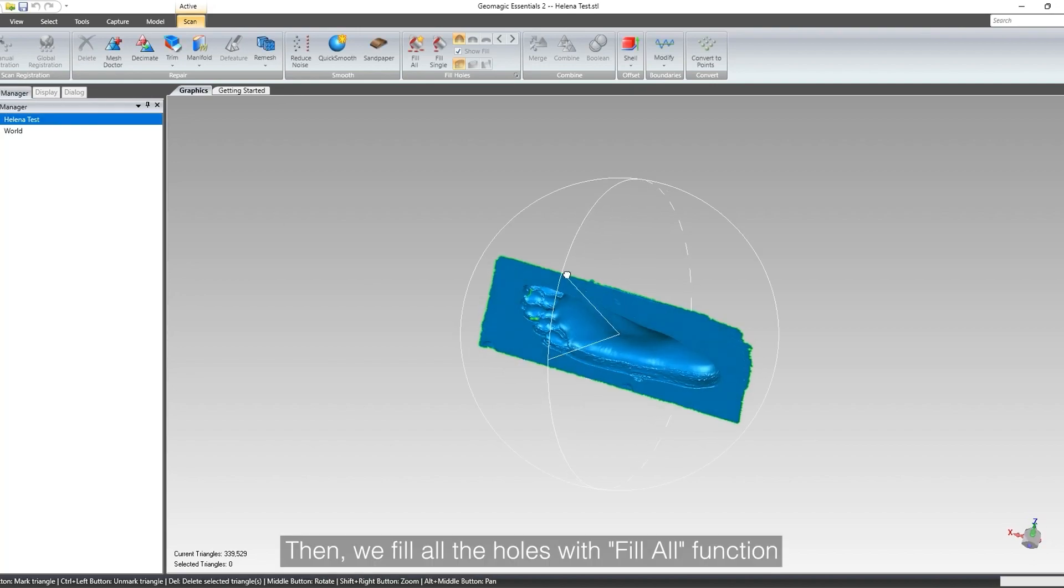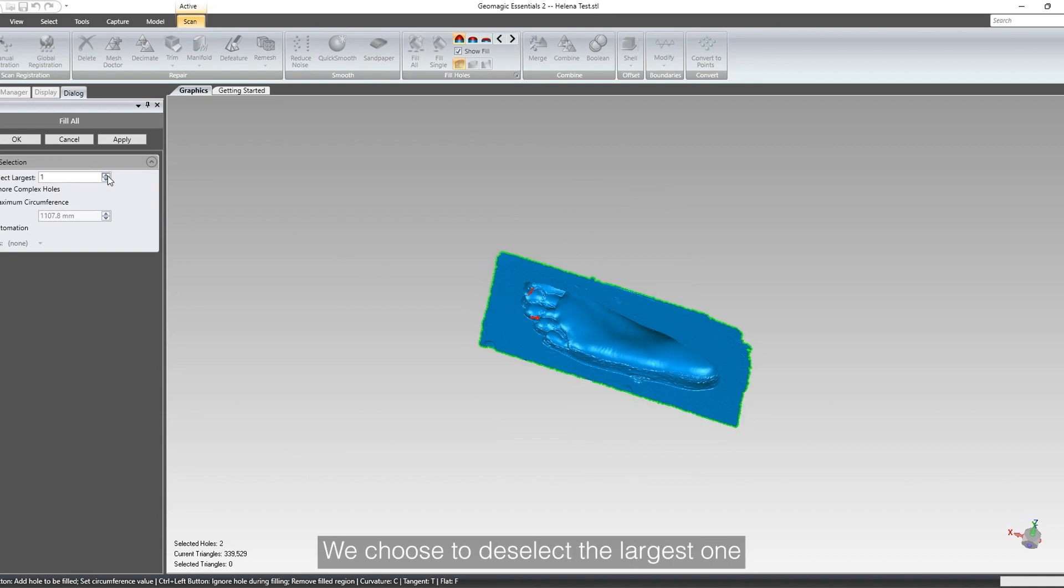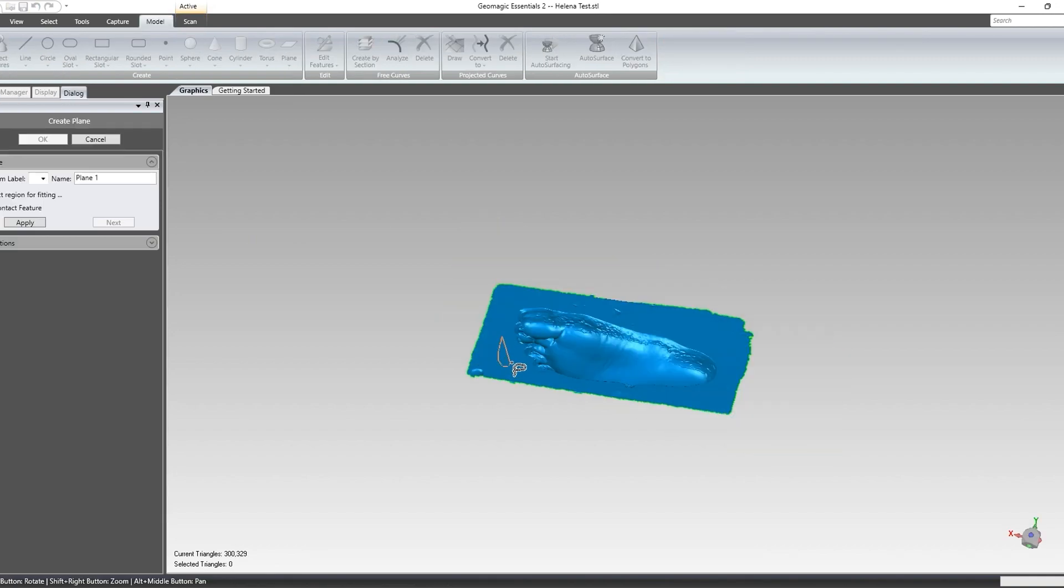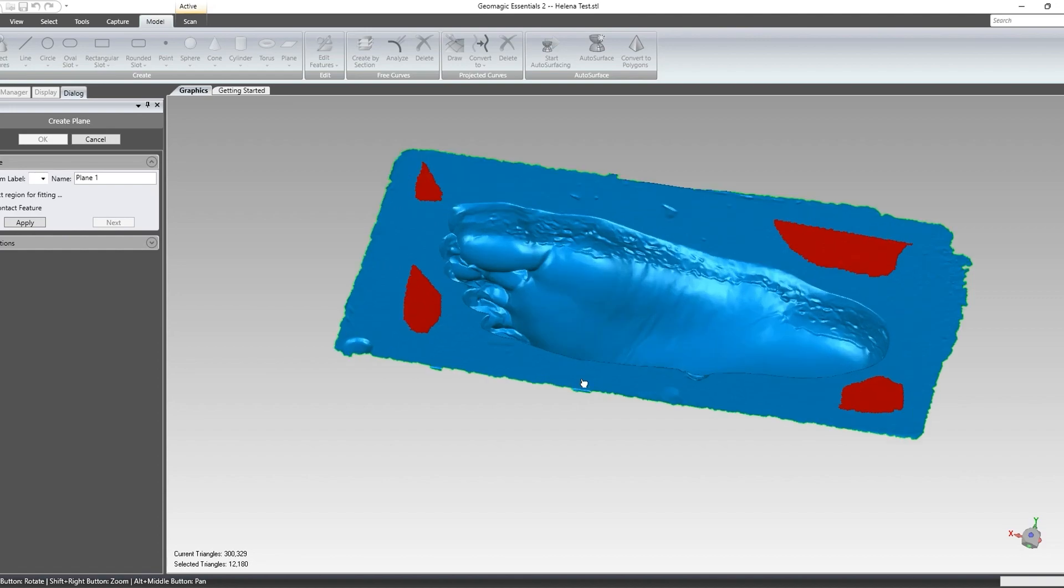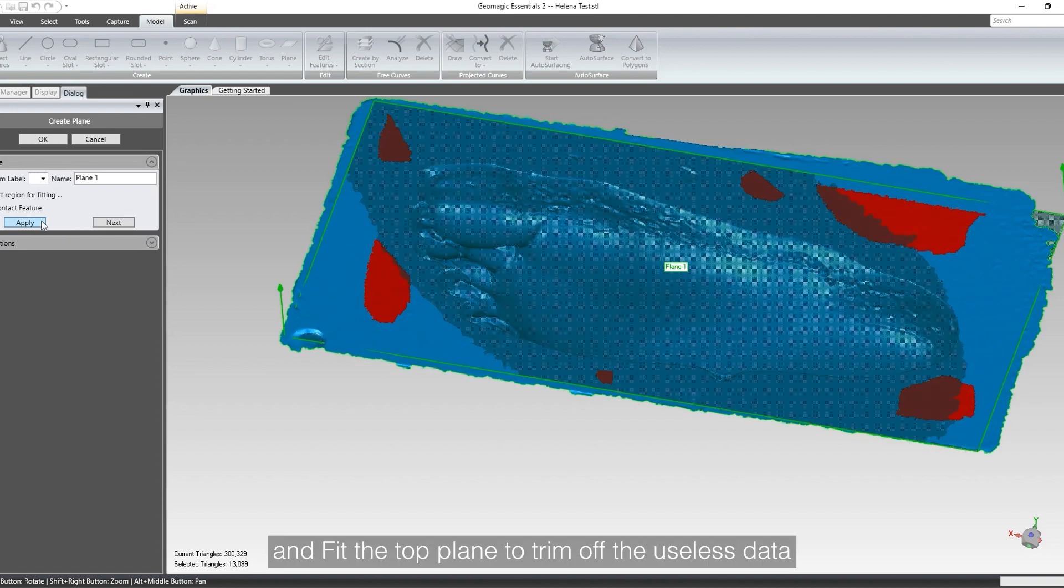Then, we fill all the holes with fill all function. We choose to deselect the largest one, and fit the top plane to trim off the useless data.